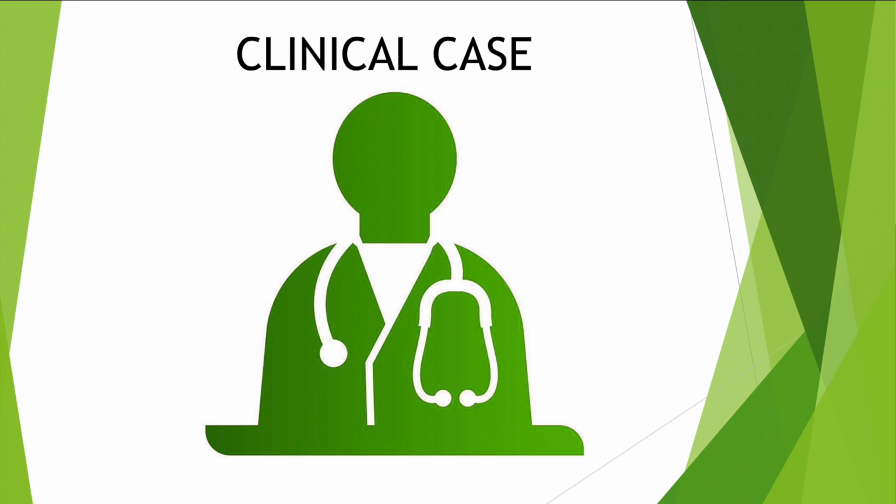So there you have it. Of course, scrotal pathology, equal ultrasound. These ultrasound scans are easy, always make for beautiful images, and don't require a lot of equipment. You can also easily perform diagnostics. It's a service to your patient. So really, I encourage you to get trained in scrotal ultrasound.